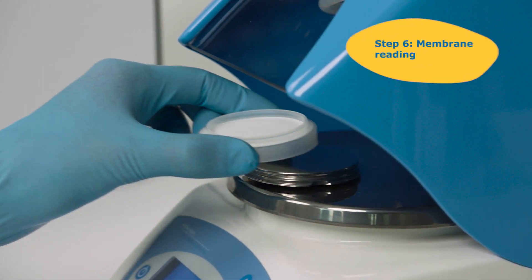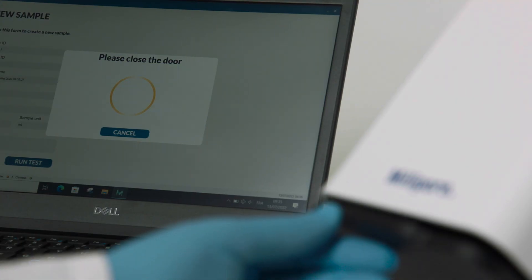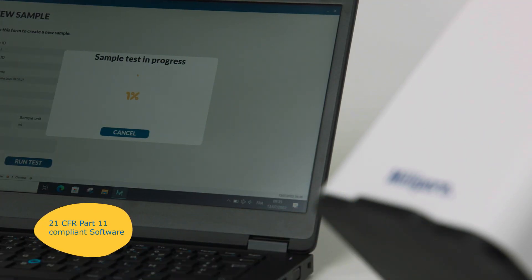When completed, transfer the membrane filter into the Milliflex Rapid Detection Tower for counting of microcolonies in the 21 CFR Part 11 compliant software.